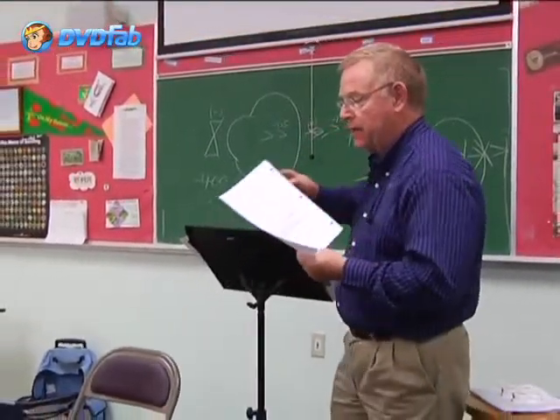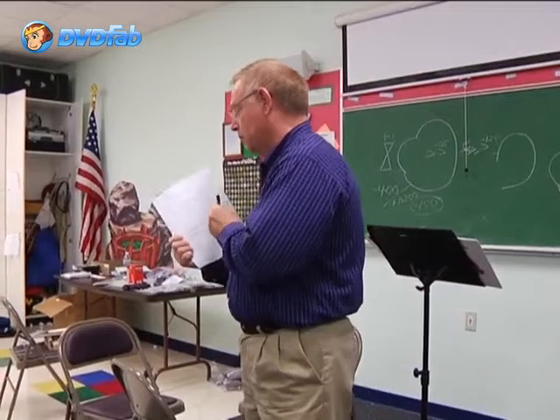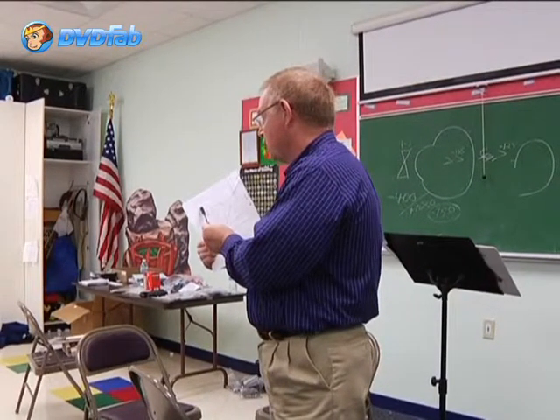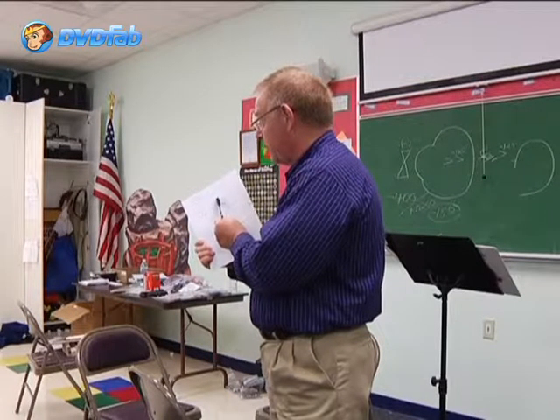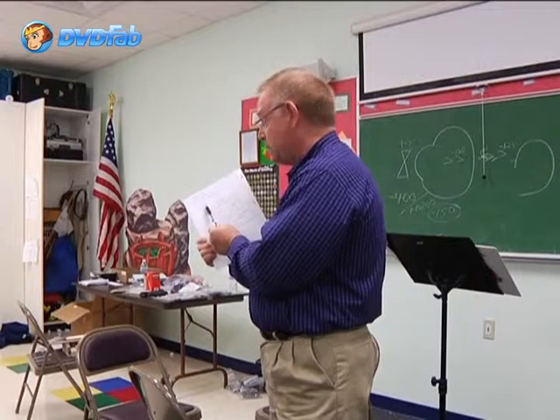Okay, all right, this says exactly the same thing, just in a little bit different format. If the chief complaint is poor distance vision, then you screen for myopia and hyperopia with your plus 1.25 and minus 1.25. If minus 1.25 is chosen, then the patient is myopic.